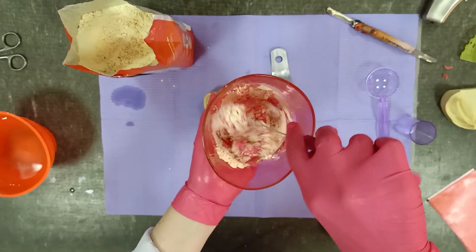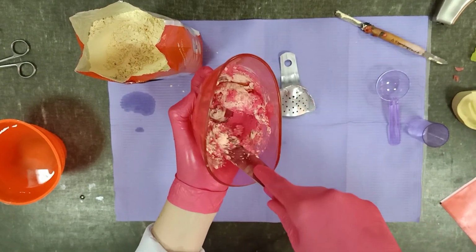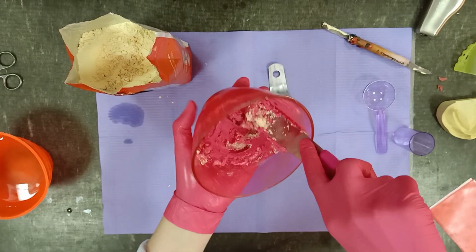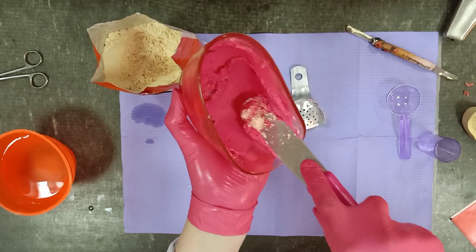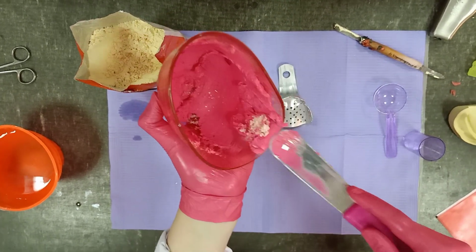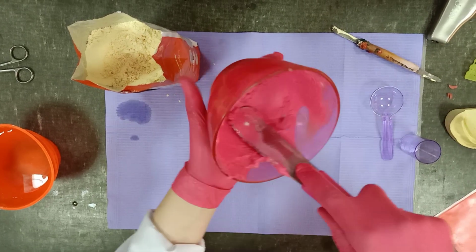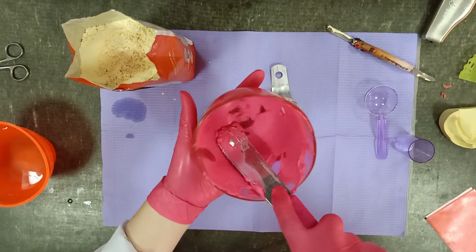First, incorporate all water into the powder. Here we used alginate with color coding. The color indicates the mixing step and the working time before you make the impression.